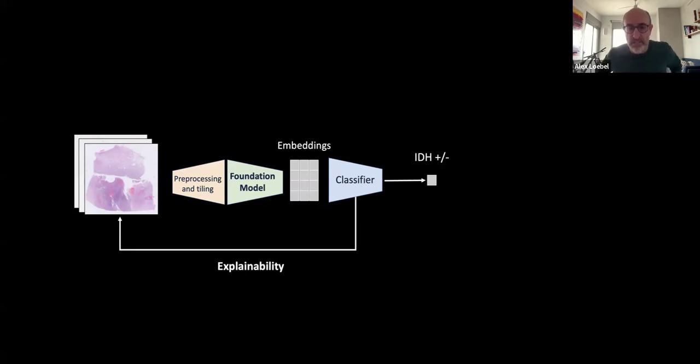So obviously in medicine, you don't just want to have the results. You also want to provide some certainty or confidence for the clinicians, that the model made the decision according to the relevant physiological features in the image. And in pathology these days, you have this idea of foundation models that I'm going to touch on and expand on a bit later on.